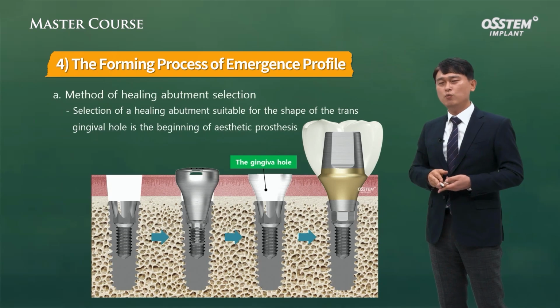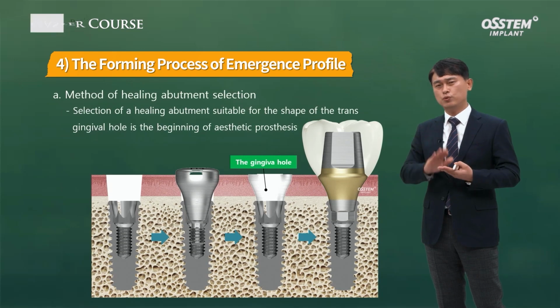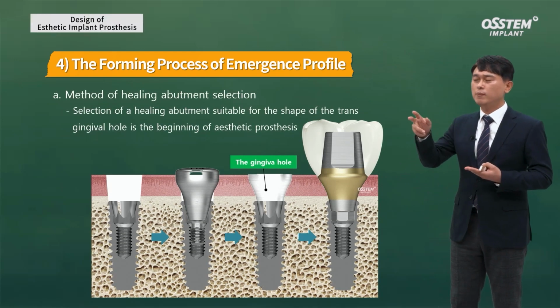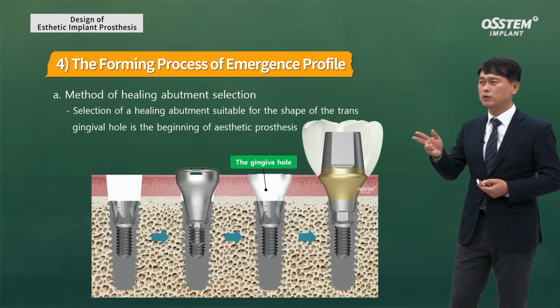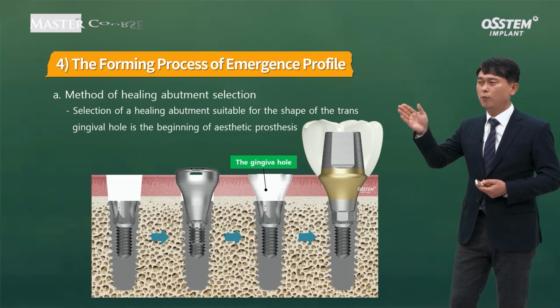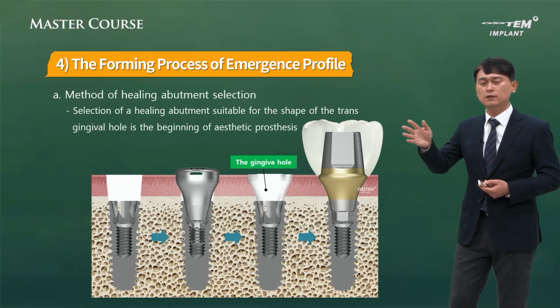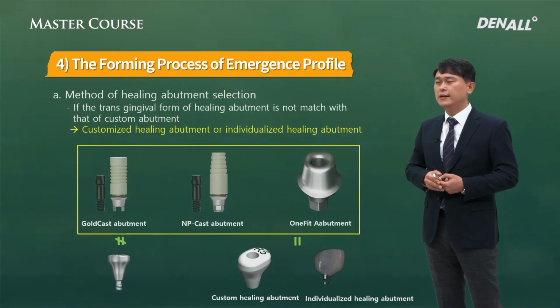It is very similar, not quite the same, but very similar. They can reduce pain or discomfort of patient when final prosthesis is mounted or removed. And the final prosthesis can be fabricated with accurate curve fitting the shape. So it is very important to select a healing abutment with the same width as the final abutment.